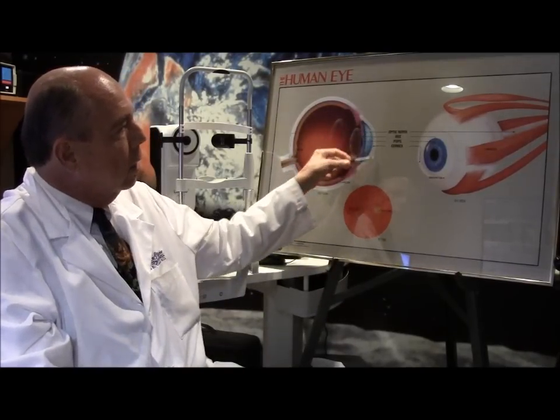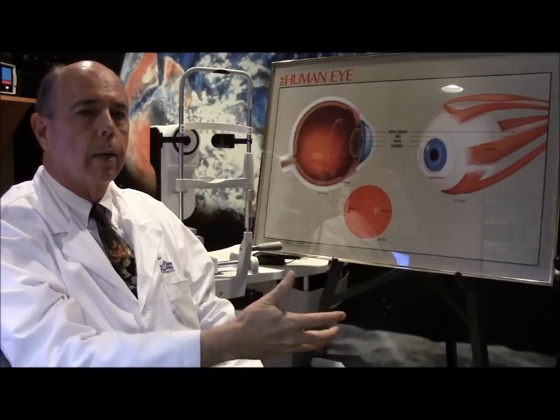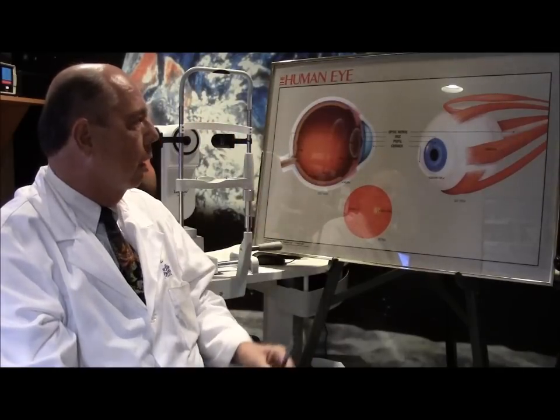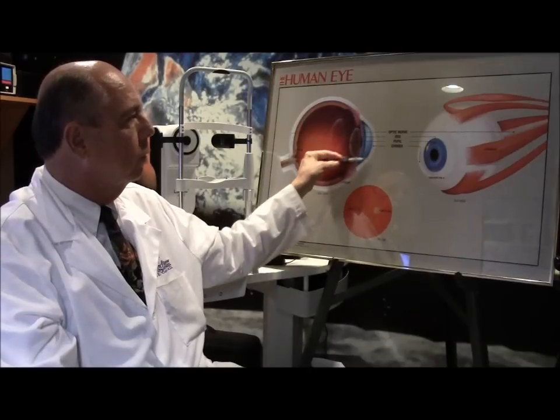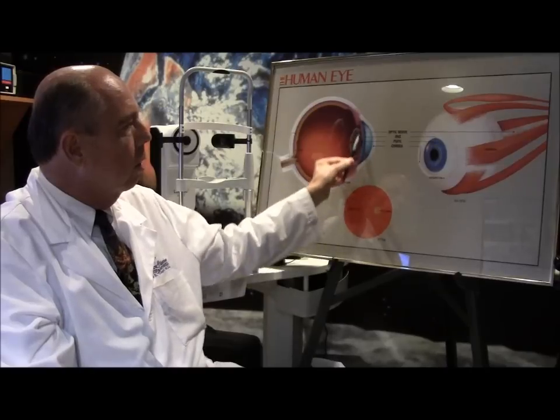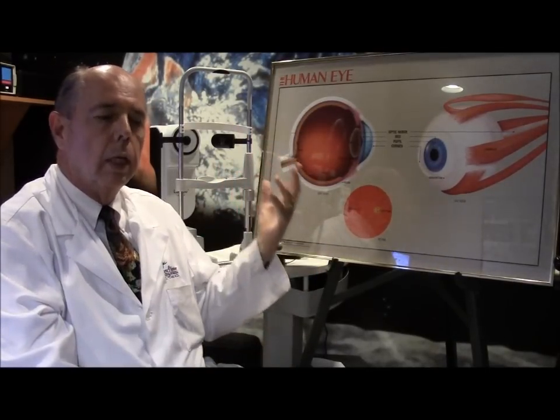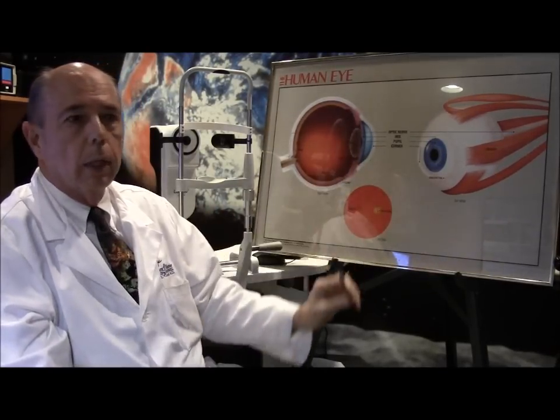The other thing that determines nearsightedness or farsightedness is how curved your cornea is — the clear part of your eye. If you have a very steep cornea, you're typically nearsighted; if you have a very flat cornea, you're typically farsighted. The LensStar measures many things, but the main two are axial length and curvature of your cornea. Another important measurement is the distance from your cornea back to where your own lens sits, or where the implant will sit. The computer inside the machine then uses formulas to calculate what strength of lens would correct your vision.